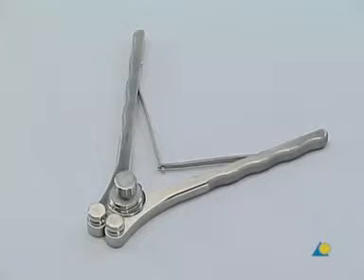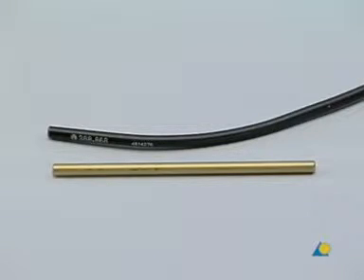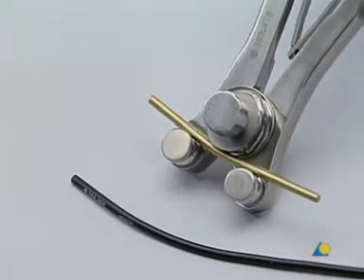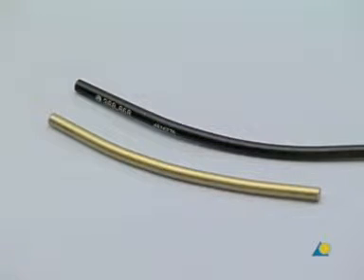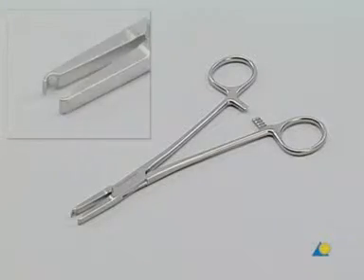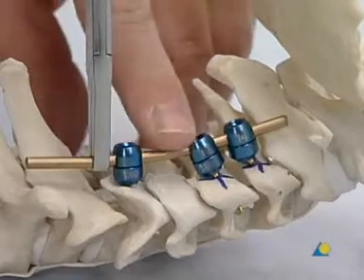For the next step, the rod is contoured with the bending pliers. The 3.5 mm titanium rod is bent to match the curve of the trial rod. Once the lordosis of the rod matches the lordosis of the trial rod, the rod is inserted into the variable axis heads of the screws using the holding forceps.